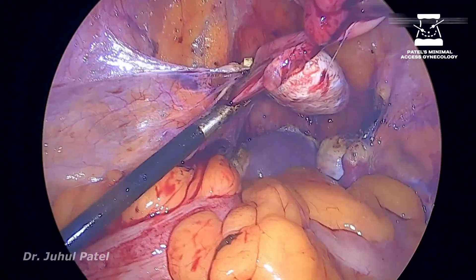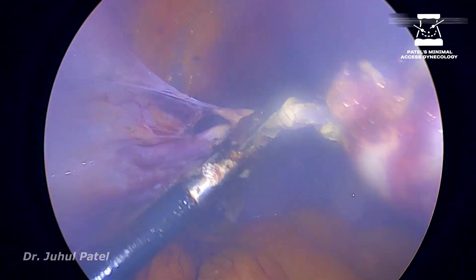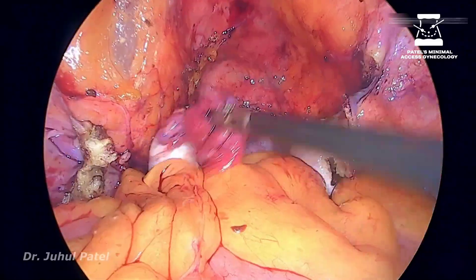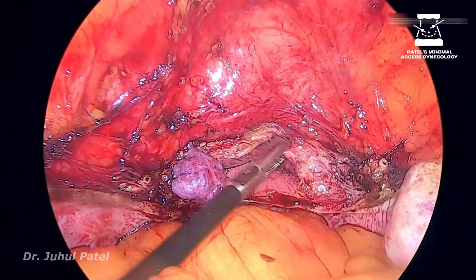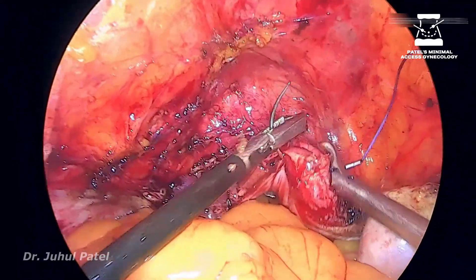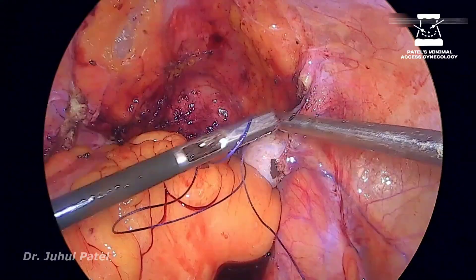This lady was posted for bilateral salpingectomy and because she was around 40, I will retain one of the ovaries. Whenever I want to retain one ovary, I always retain the right one, because the left side is always tricky. If she comes up with an ovarian cyst in future, it is always easier to remove the right side than the left side because of the sigmoid. So whenever one ovary has to be preserved, just remember — remove the left ovary. It will make your next surgery smoother.